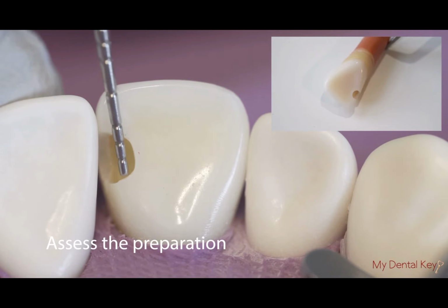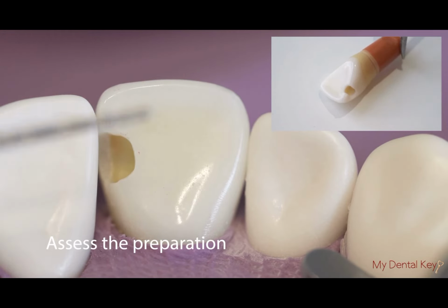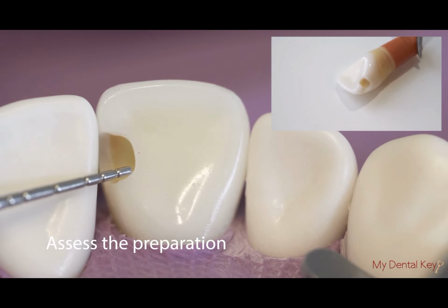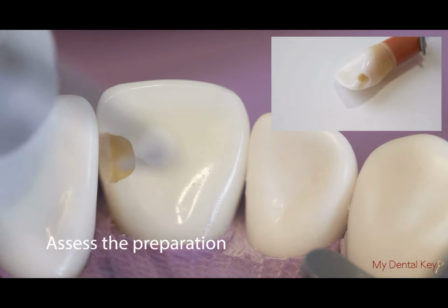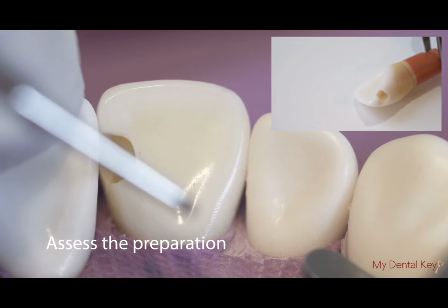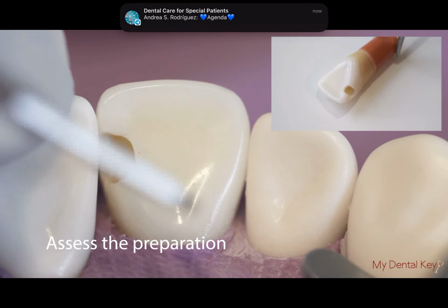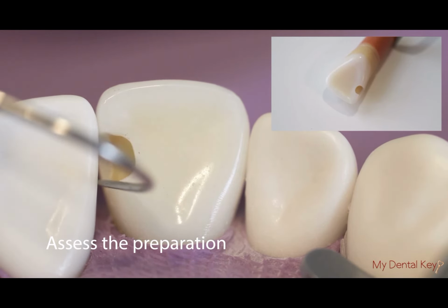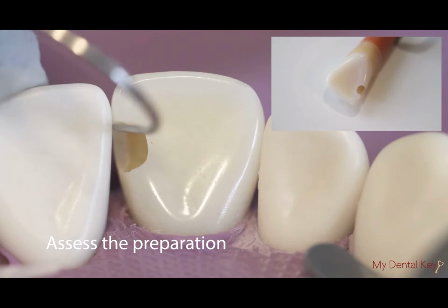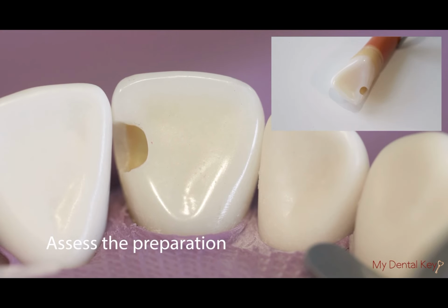The outline form should be less than 3 millimeters in the incisal gingival direction and extend in the mesial distal direction about 0.5 millimeters to less than 1 millimeters beyond what's necessary to remove all of the carious lesion. Note that the final preparation dimensions in the facial lingual direction will be determined by the carious lesion. The preparation should have gingival clearance less than or equal to 1 millimeter. The preparation should also ideally be smooth and the cavo surface margin should be regular.